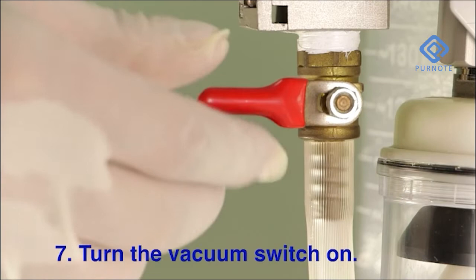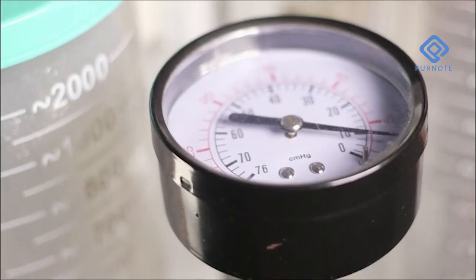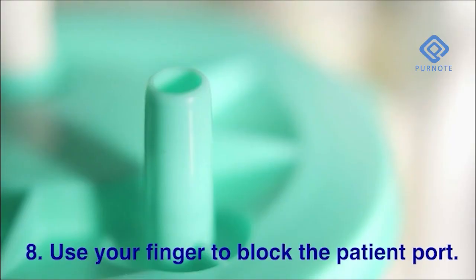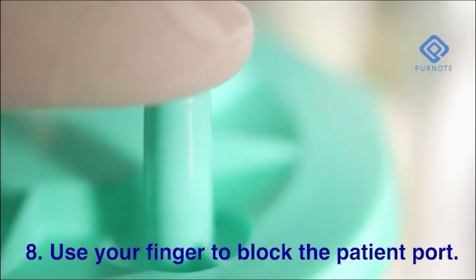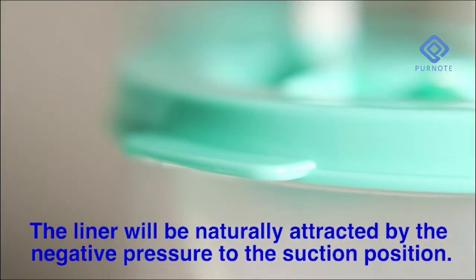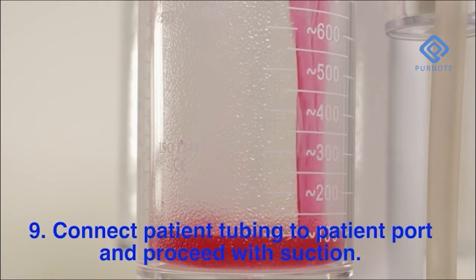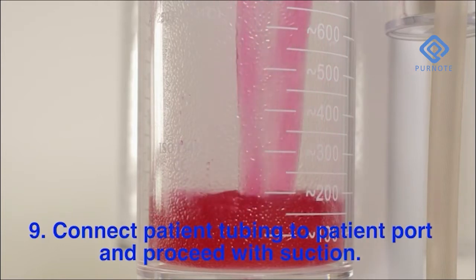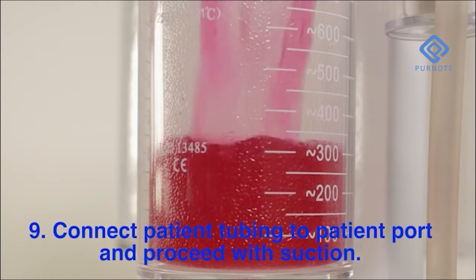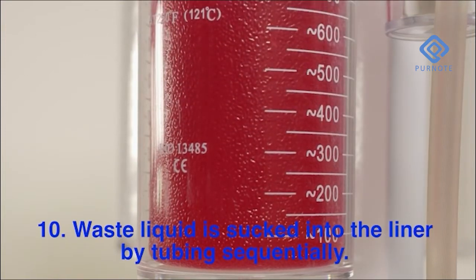Turn the vacuum switch on. Use your finger to block the patient port. The liner will be naturally attracted by negative pressure to the suction position. Connect patient tubing to the patient port and proceed with suction. Waste liquid is suctioned into the liner by tubing sequentially.